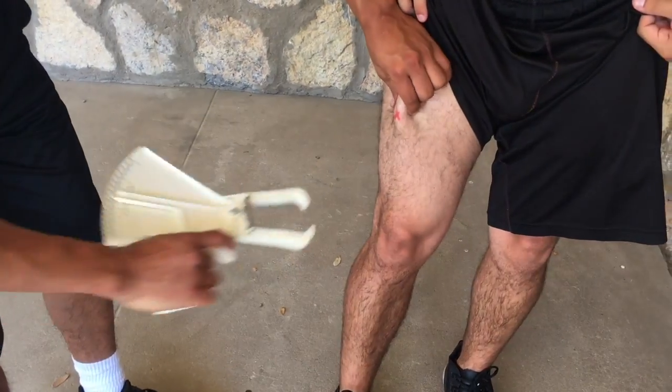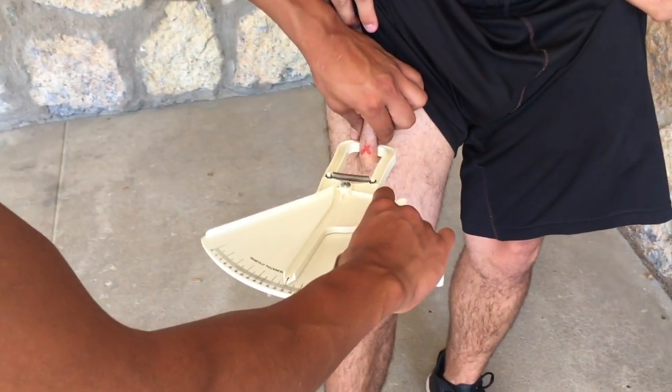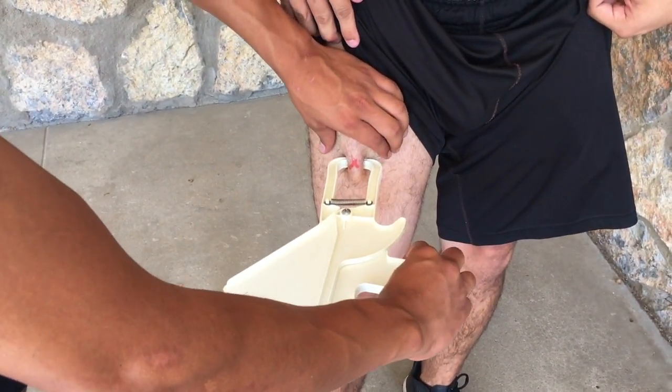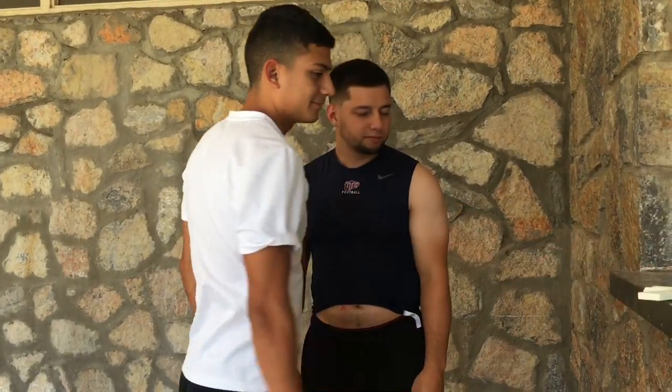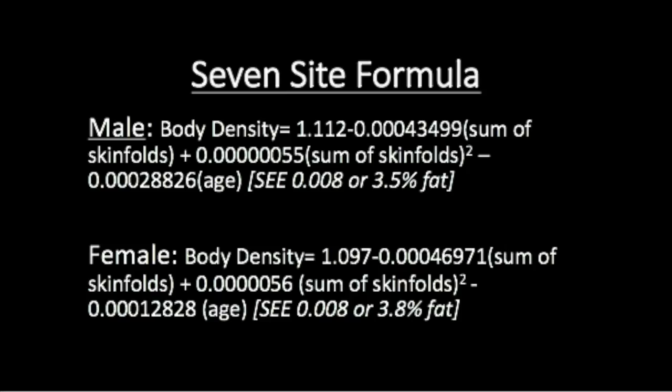The thigh is a vertical fold measurement. Be sure to have the client place all of their weight on the left leg. After calculating the average for each skin fold site, use the client's measurement and validated skin fold equations to estimate percentage body fat.